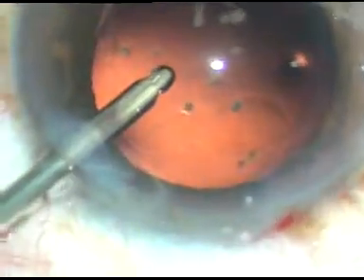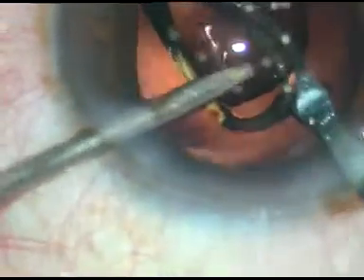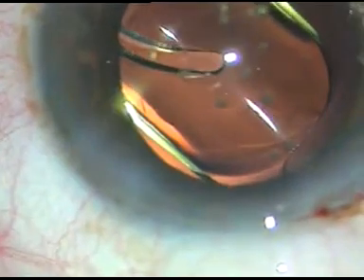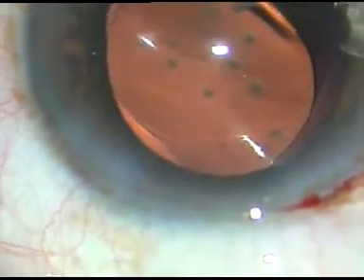Now a little bit of enlargement of the main incision. In this case I am using a hydrophobic acrylic intraocular lens, and it is being implanted under irrigating fluid. The irrigating fluid is keeping the anterior chamber formed, and the lens goes into the capsular bag.